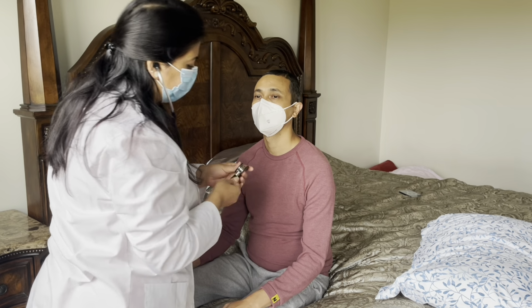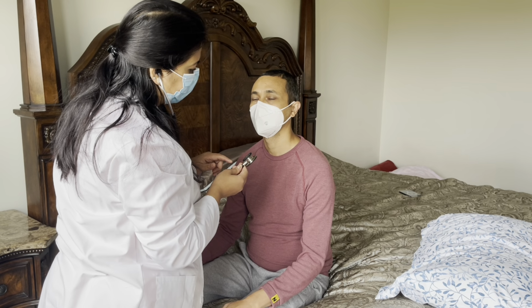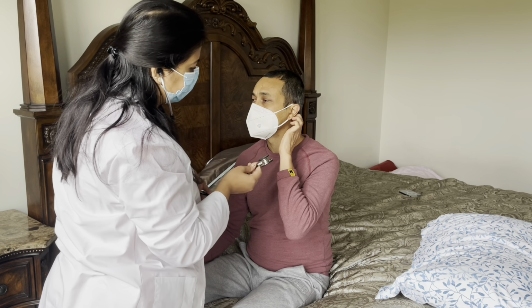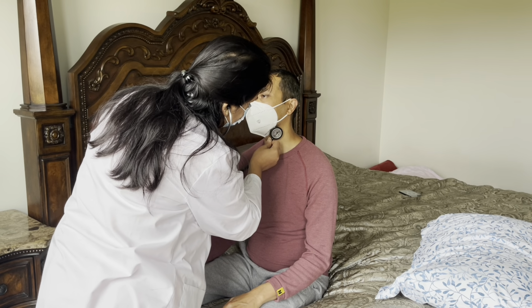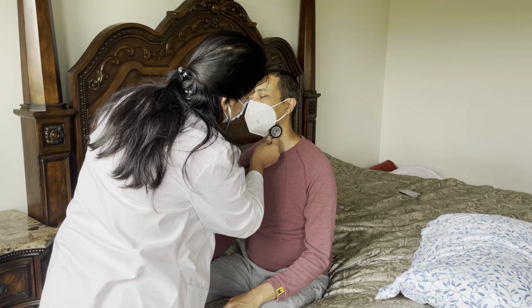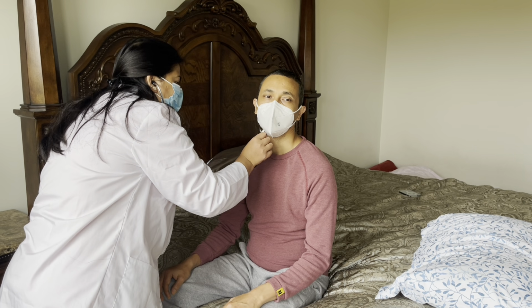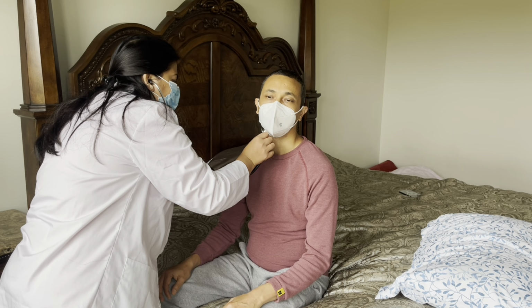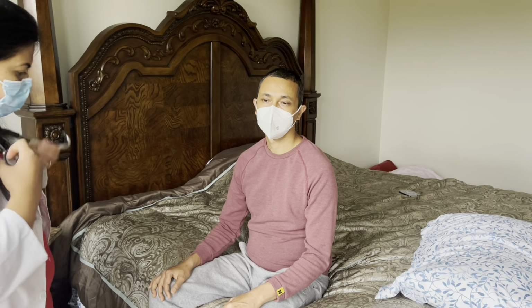And I'm going to auscultate your carotid artery with the bell of my stethoscope. If I use the diaphragm, I can hear extra sound, so I'm going to use the bell of the stethoscope here, listening, and then I'm going to compare the side. Yeah, I can hear.